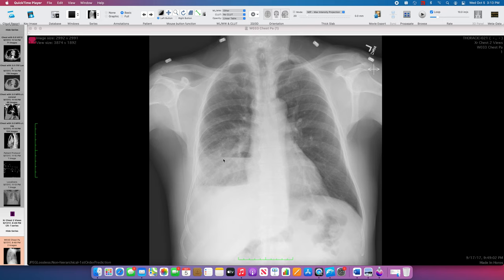I do see a very well-defined linear border, and superior to that border it's radiolucent and inferiorly radiodense. Also laterally, I've got a little bit of a meniscal sign out there, telling me that I've got some pleural fluid out laterally.